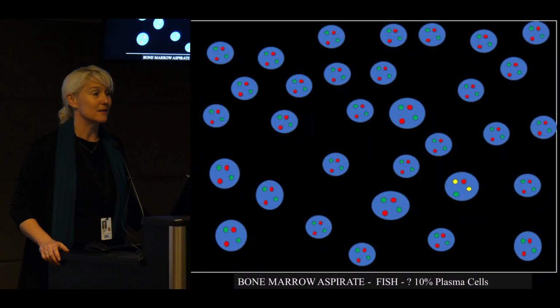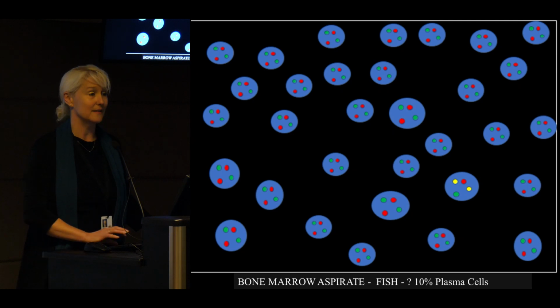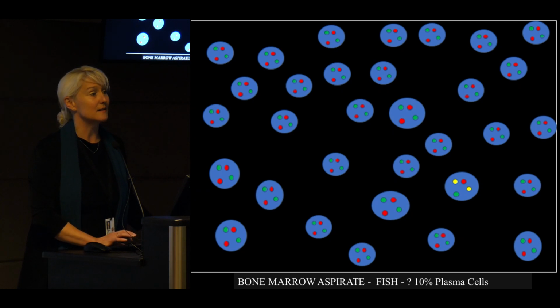So when we go back to our slide, morphological identification is not possible, nor are we trained in morphological identification of these cells. So all cells look very much similar because we're only staining the nuclei. And so we score all cells. And as I suggested, this case could be reported as a false negative.